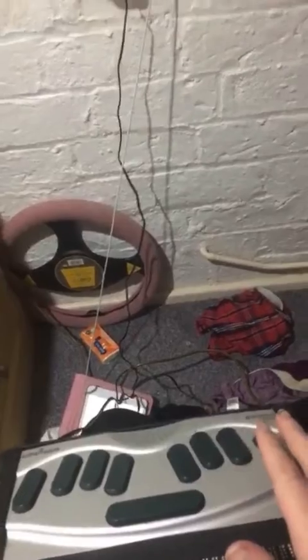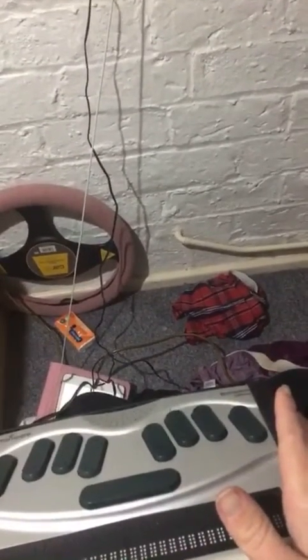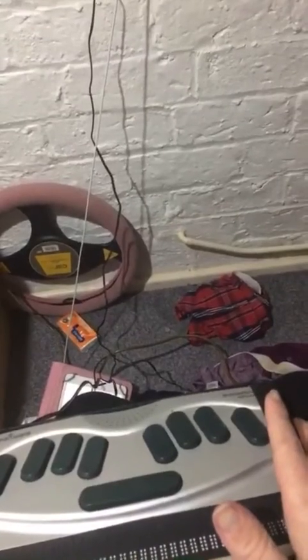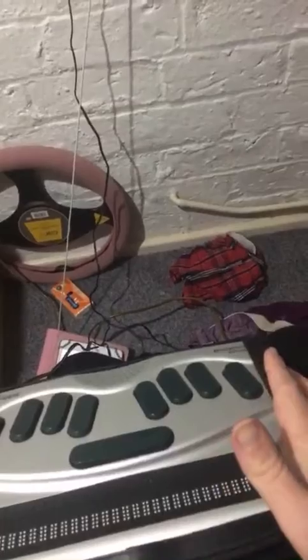Now, whatever you do on the Braille Note, you need to make sure that your Braille Note is fully powered. Either you're plugged into a wall or you've got full battery power to do this.